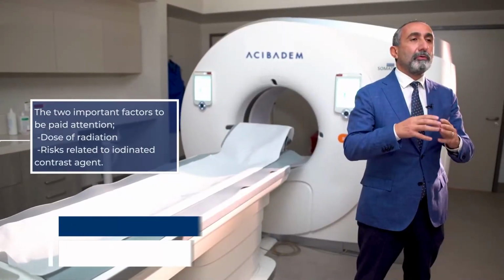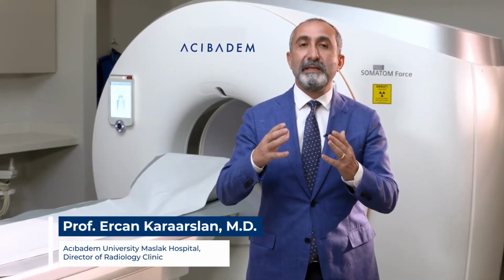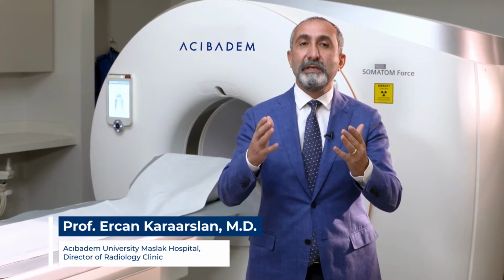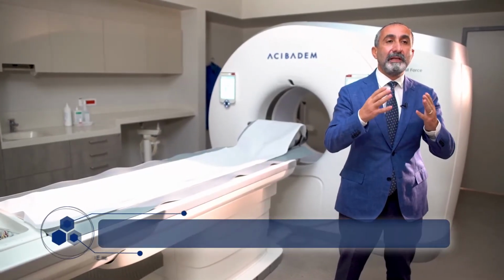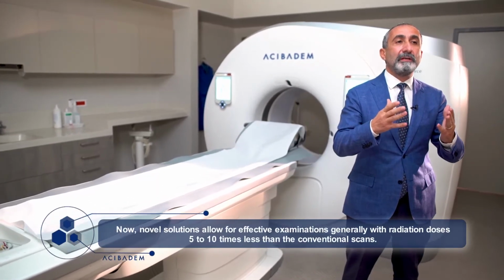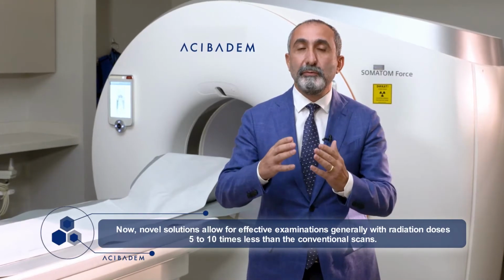Here, the radiation dose and the risk arising out of the iodinated contrast agent require utmost attention. Novel scanners enable very quick scans that may diminish the dose of the contrast agent. Now, novel solutions allow for effective examinations generally with radiation doses 5 to 10 times less than conventional scans.